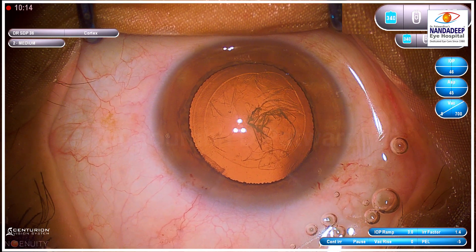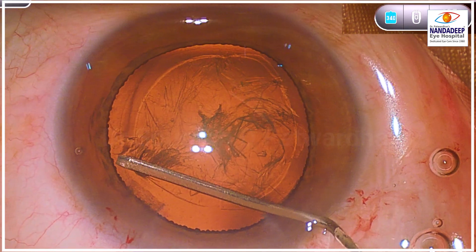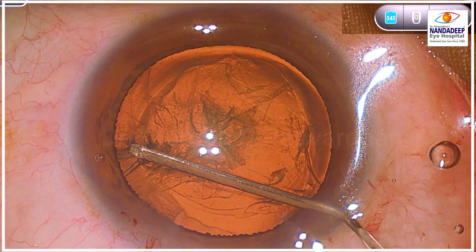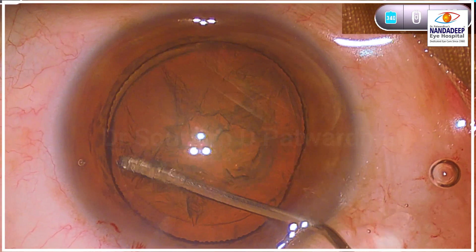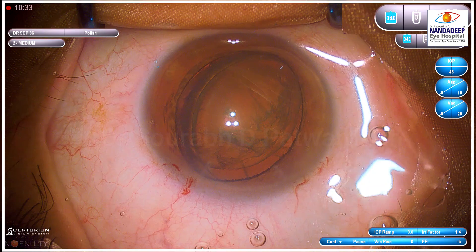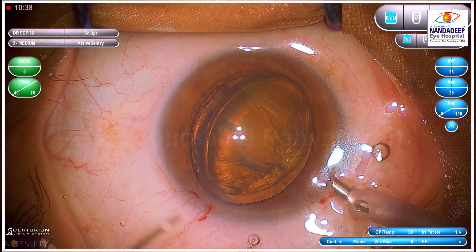Whether this should be the technique of choice for these grades of cataracts — generally I have used it in grade 1 and grade 2 cataracts where I could do a good hydro-delineation and then prolapse the nucleus out. But here you can see it's a grade 3 cataract. I was able to prolapse one pole of the nucleus out. The capsulorhexis was good at 5 millimeters, which is essential for this technique.